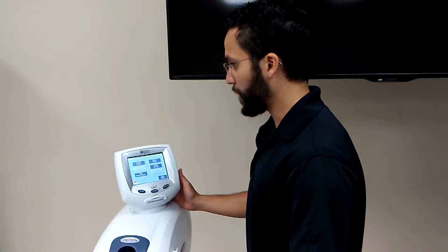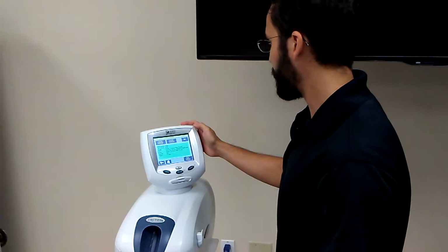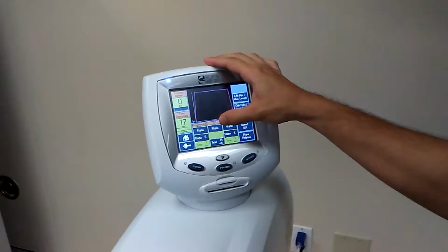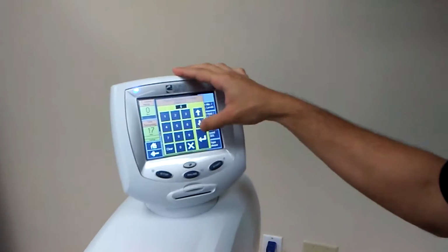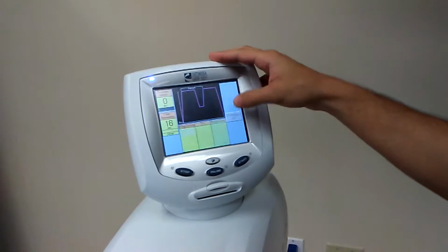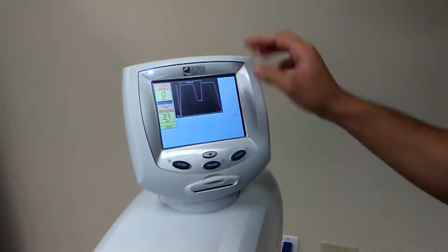Parameters for lumbar traction for muscle spasms. So first we're going to go to lumbar traction. Going to edit. We're going to do intermittent. We're going to have 0 progression, 0 regression. Time should be 20 minutes.